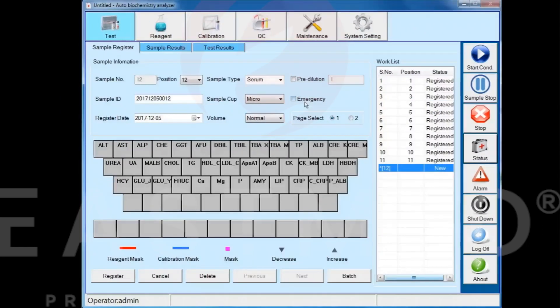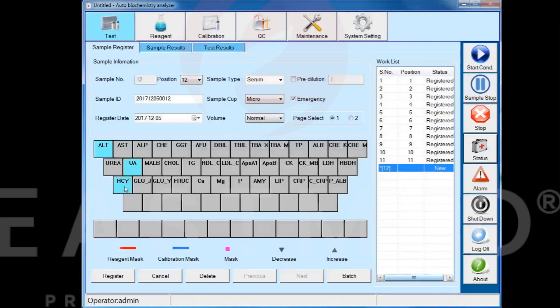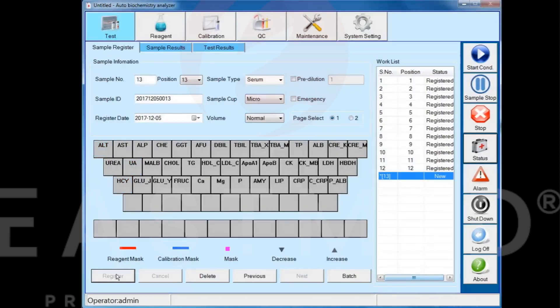When the instrument is running and there is an incoming emergency sample, you can use emergency registration. Choose the emergency function, select the test items, then click the register button to complete the emergency registration. Emergency samples will be tested next, shortening the waiting time.